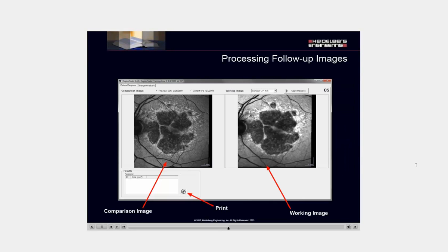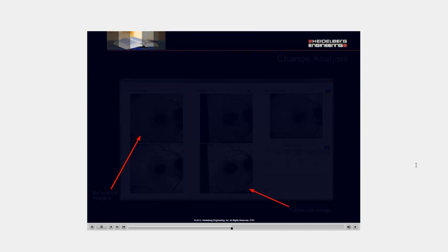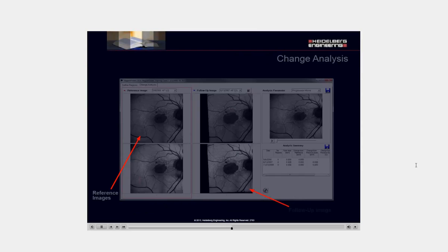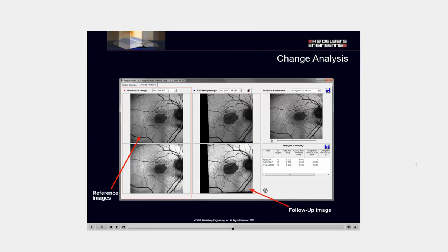In a follow-up image, you still have your working image on the right, but a comparison image on the left. Your comparison image is a previous image from an earlier exam. Under the change analysis tab, your reference images are on the left, your follow-up images are in the center, and any analyses are all the way to the right.